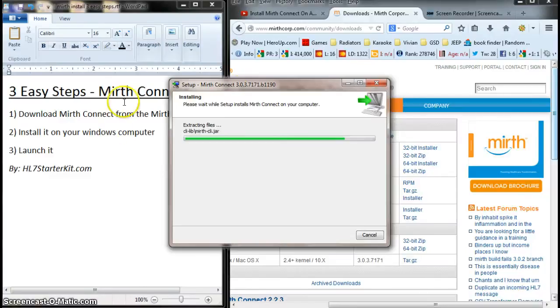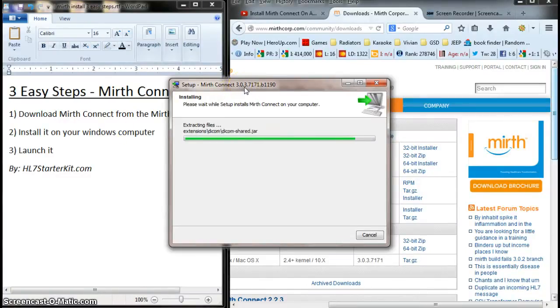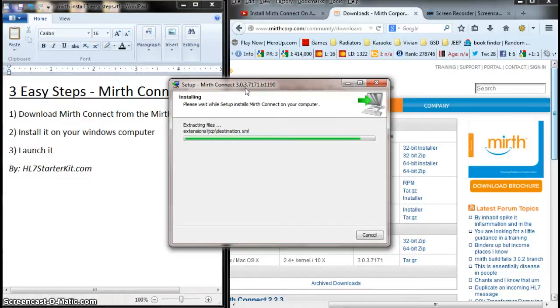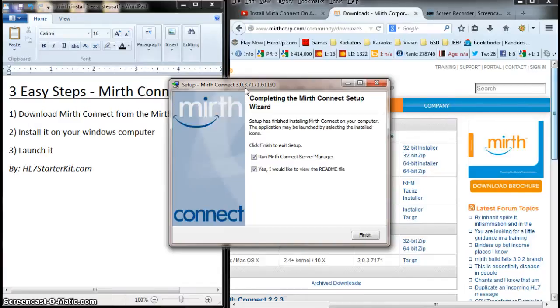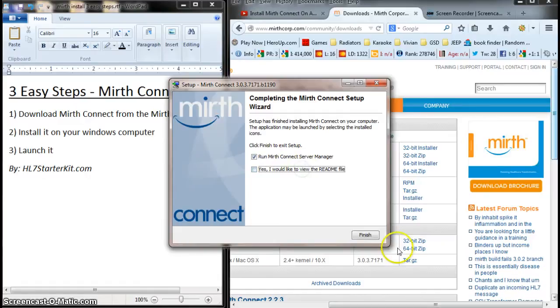And this is version 3.0.3, which I actually also use professionally at work. So, it's a pretty cool version. Really neat features. But, I just want to install it and make sure it runs. Run Mirth Connect. I don't need that. Let's run it.